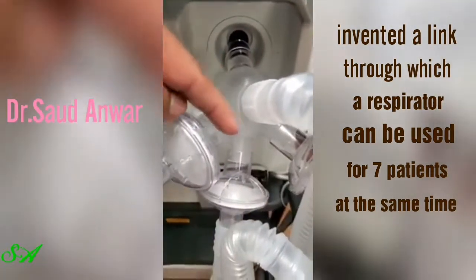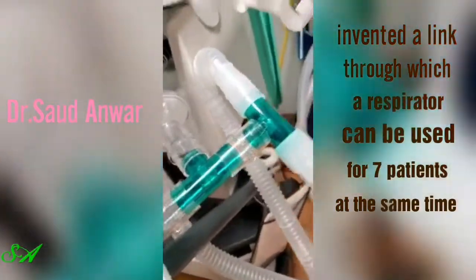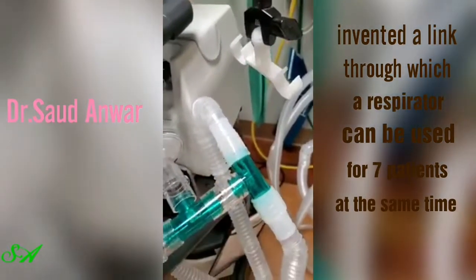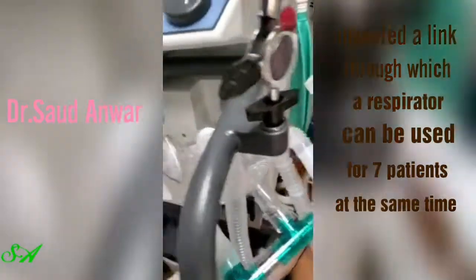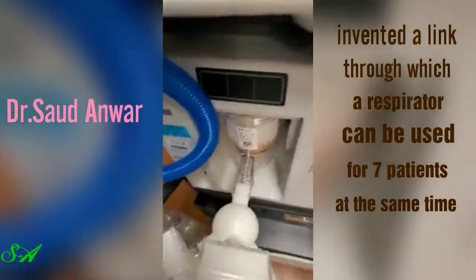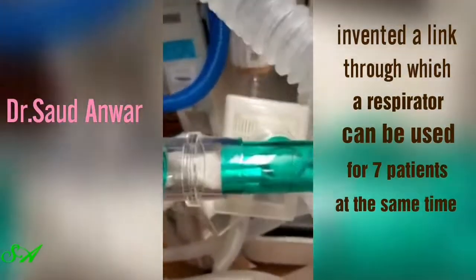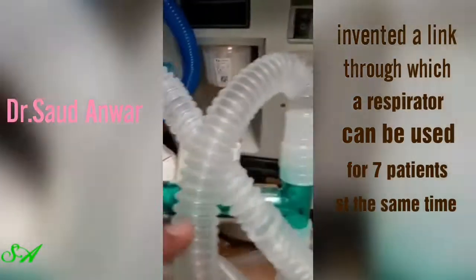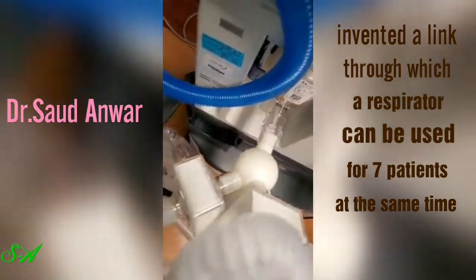Now, if you look, we have the 4 branches, and on one of those we have put a T-piece and divided it into 2 pieces, and then each of those 2 is divided into 2 more. So this one outlet is equal to 4, and then 5, 6, 7 patients are connected to this. On the exhalation part, we have a similar setup, with a different color so that we can separate them out. These are again the filters we have placed in. You're seeing the T-pieces connected with 2 extra ones and 2 on this side, and then we move forward and see that there are 3 others connected to this.